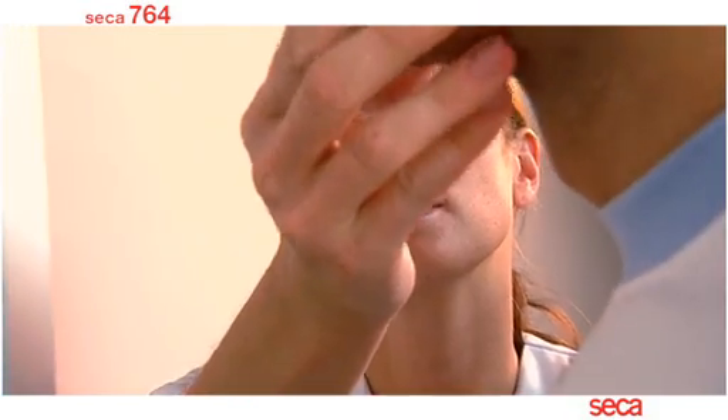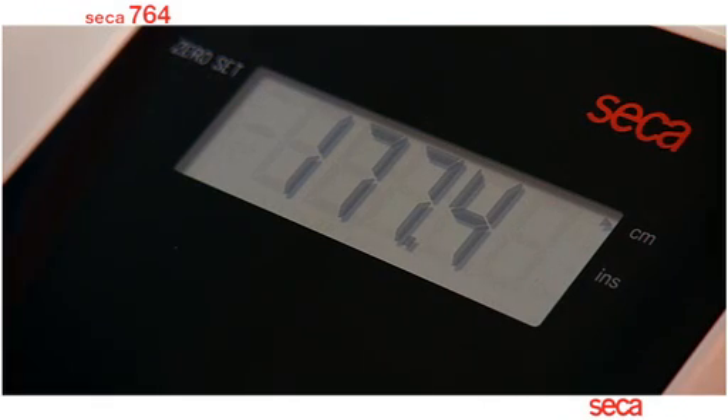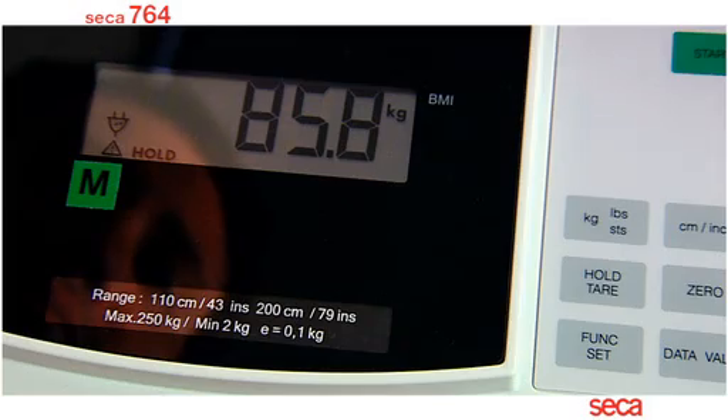The correct height of the patient is important, as both height and weight measurements will be used by the Sika 764 to automatically calculate the body mass index.